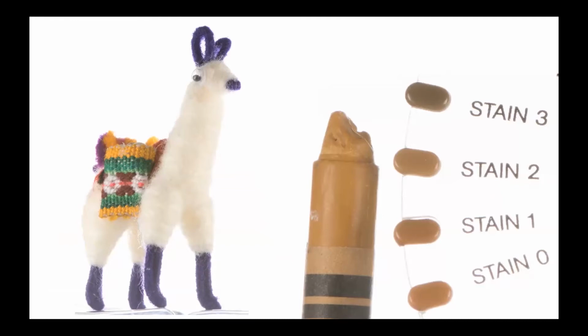I can compare the shade of the die, and I can find the grain of the proper shade that is practically equal to this shade. At the same time, I can melt together different crayons, for example, red, yellow, and gray, and add them in different ways to my dentin wax, and this way I get the die of the proper shade.